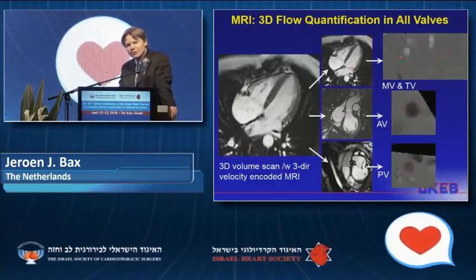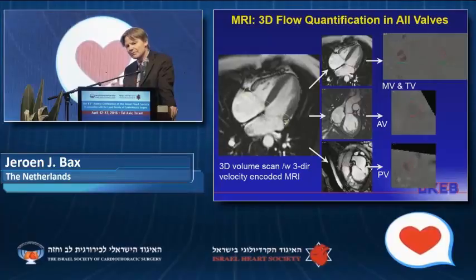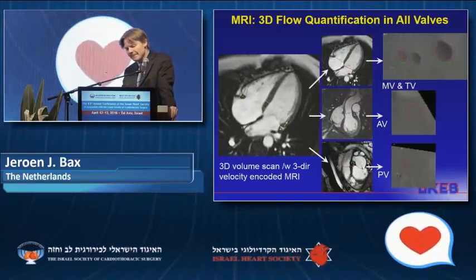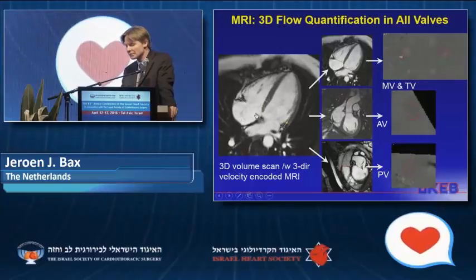It's very difficult, and especially you see that when we try to judge the MitraClip studies. Nobody knows really how to measure the endpoint in terms of severity of mitral regurgitation after MitraClip. You could do an MRI. I've shown this slide a couple of times. It's an older study that we've been doing. It works very nicely.